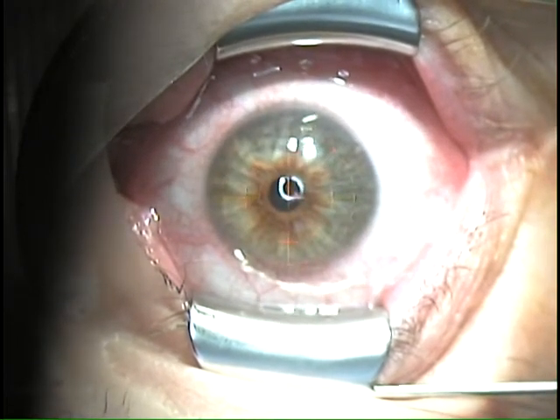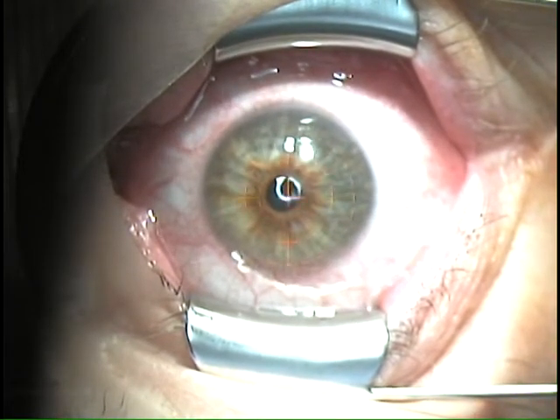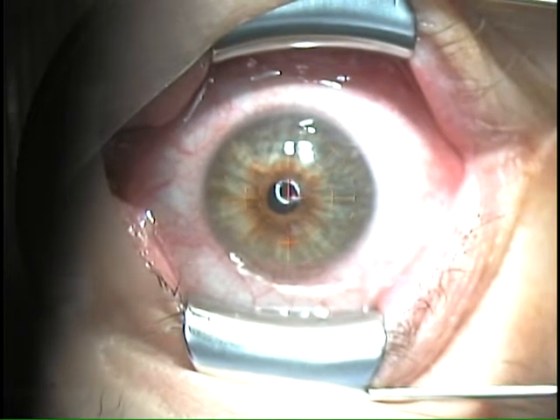This is Dr. Todd Fladen of the Fladen Eye and LASIK Center, videoing for GoogleVideo.com, October 30th, 2006, on our VizX-Star 4 laser.